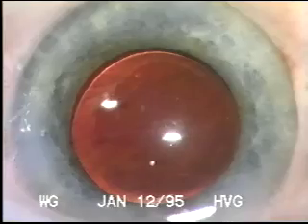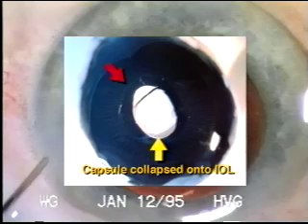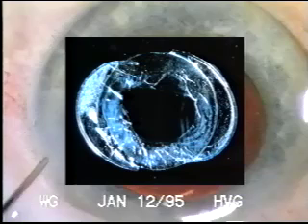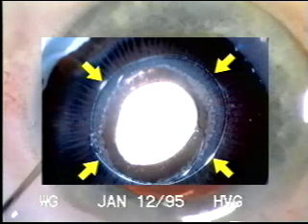In a pig eye we have shown collapse of the capsular bag where zonules were broken in the yellow area, whereas the bag is still circular in the area of the red arrow. We have seen clinical situations where the capsule completely collapses and contracts around the implant, and we expect the endocapsular ring to prevent this contracture and ripping off of additional zonules.